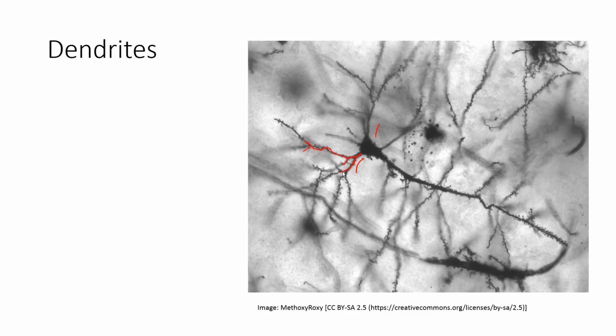This one is going to branch this way and this way. This branch comes like this. You get the idea. It's mixed, lots of branching. The term for this branching is arborization. You guys know what we celebrate on Arbor Day, right? It's all about trees. And this branching pattern is very similar to how tree branches look. So arborization means to branch like a tree.